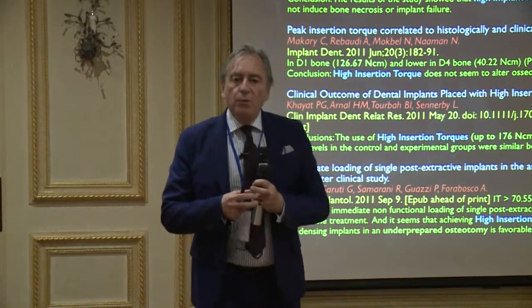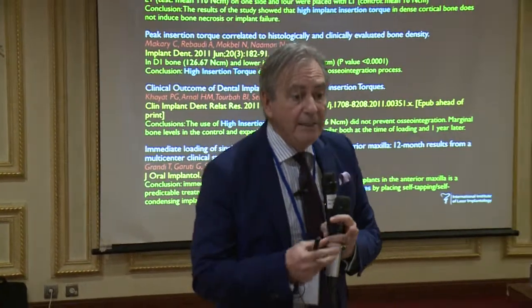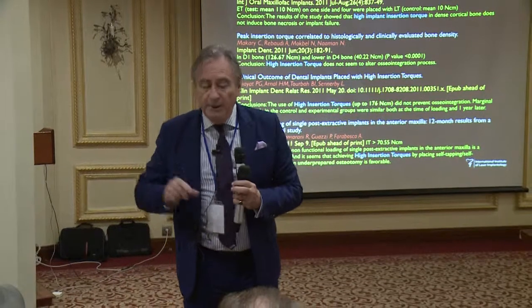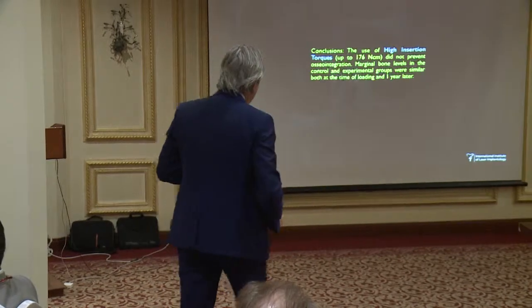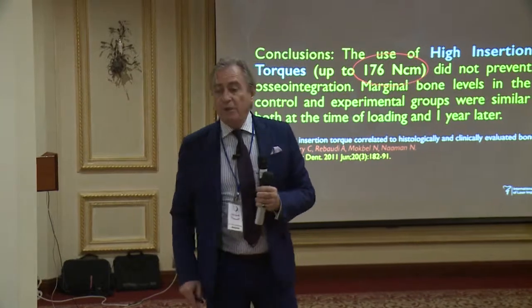But if you undersize your bone preparation, remember the example of the screw in the wood, you will have to apply a high torque. And again, there are a lot of publications showing up to 176 Newton centimeters.